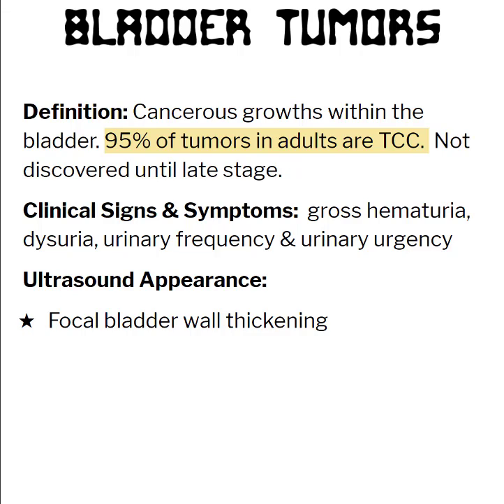Unfortunately, most of these cancers are not found until very late stages, so it is not always going to have the best outcomes, but sometimes we do see them incidentally. When I have been scanning aortas, I've been coming down to the iliacs, going past the bladder, I have seen cancer a couple times that way. I've had colleagues that have found cancer doing pelvics on women.